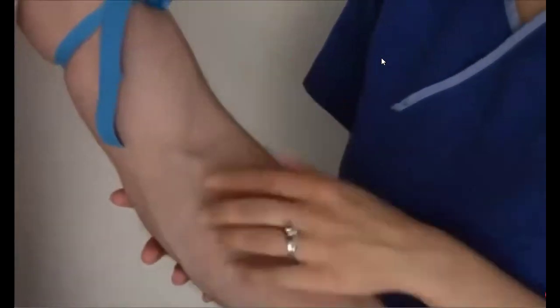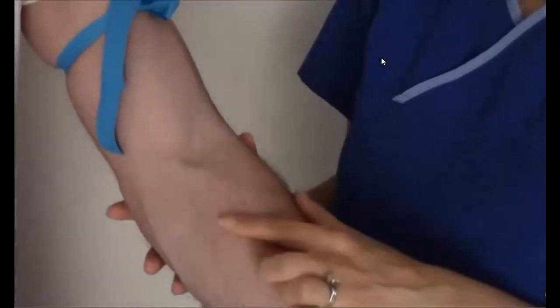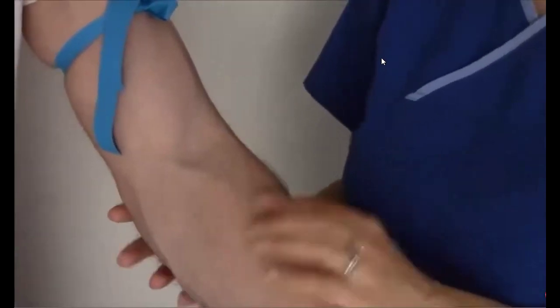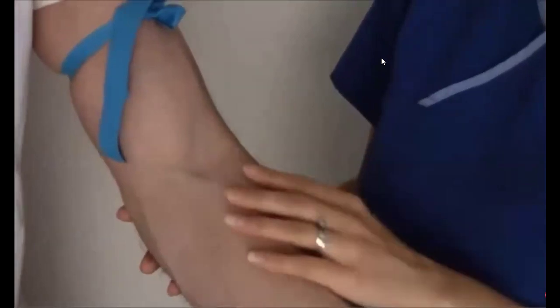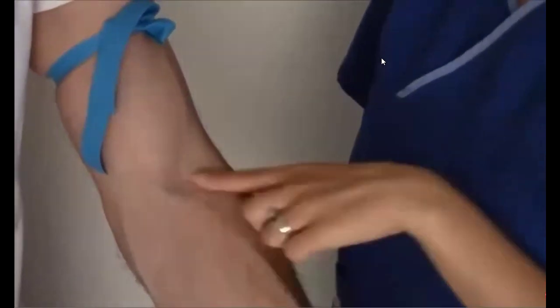So first I want to talk about the antecubital area. This is the AC area. You may hear in the hospital setting the nurse say he has an 18 gauge in his right AC. So this is the AC area that they're talking about. Typically in the human, the veins are always in the same spot. So everyone should have the same veins in the same areas. They can be a little bit to the left or to the right, but generally they'll be in these areas.